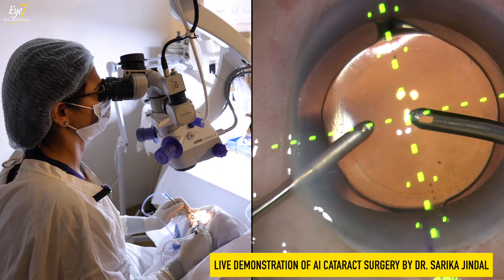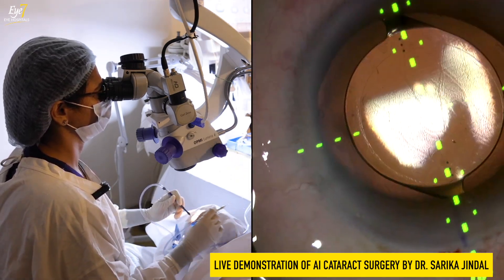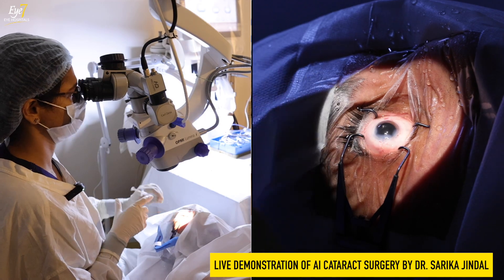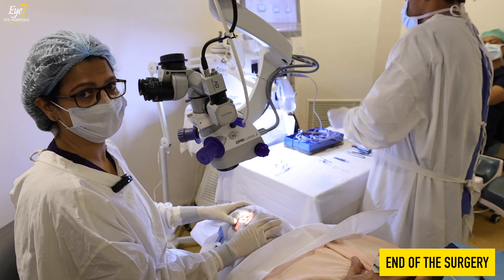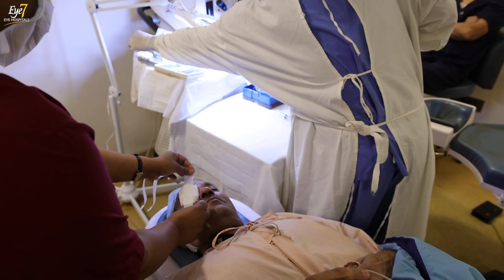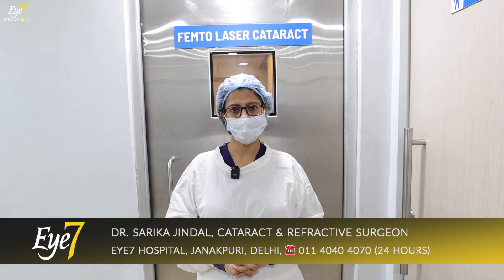I have removed all the viscoelastic from the bag and the eye is beautiful and clean. We have finished the surgery. The patient can start putting his eye drops after half an hour and will be discharged from the hospital after one hour. The surgery is complete and the patient has been sent to the post-operative room. The patient will be discharged after one hour, after explaining all the medications to be taken, and will be followed up tomorrow in the OPD.